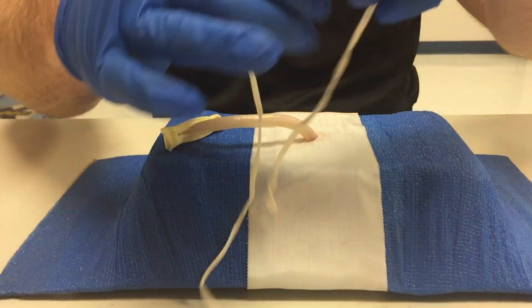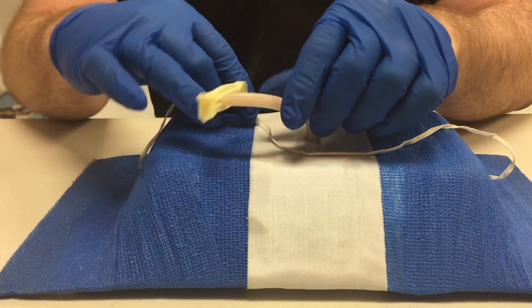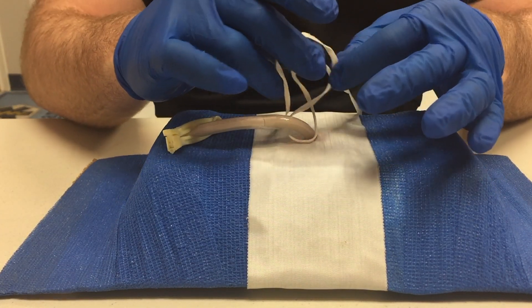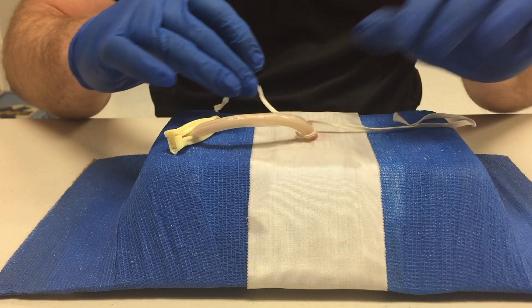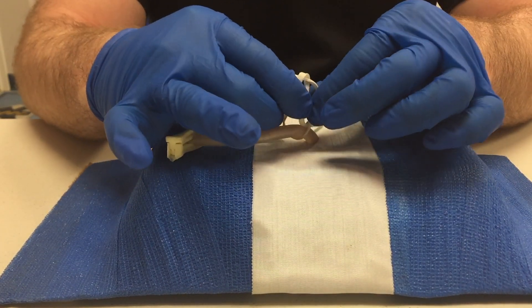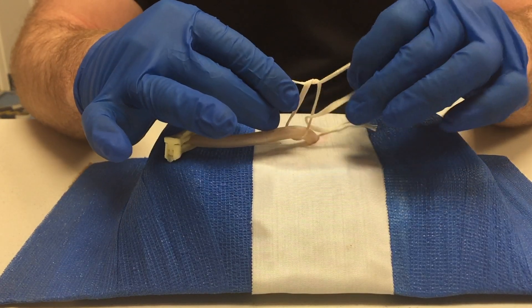Now the paramedic will use the cotton tape to tie a firm knot around the base of the umbilical cord to occlude the vessels, so that when he makes the cut through the umbilical cord there is no bleeding from the umbilical cord.